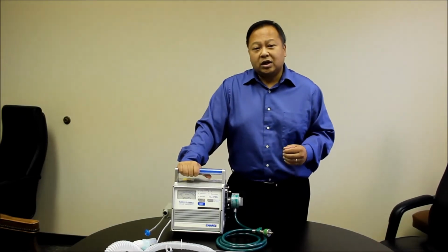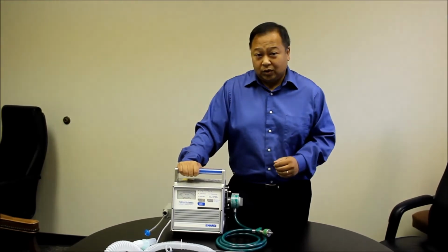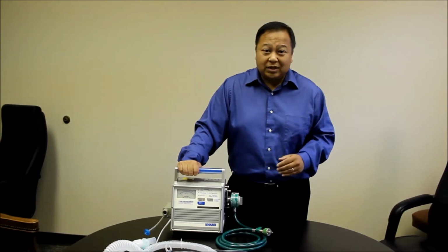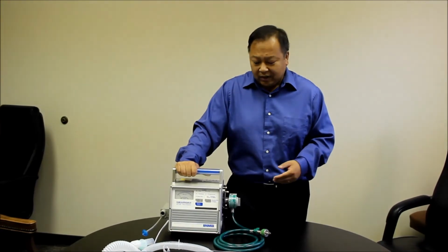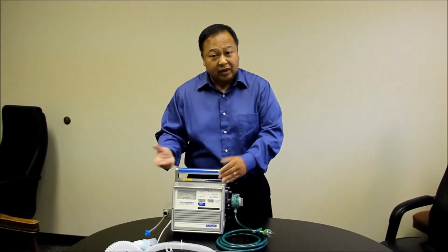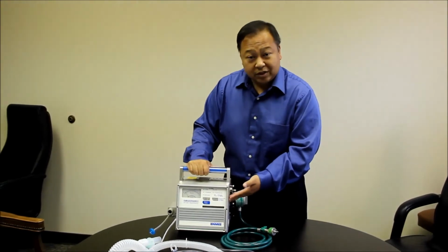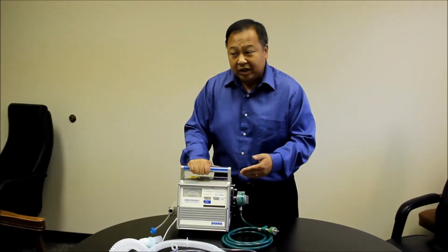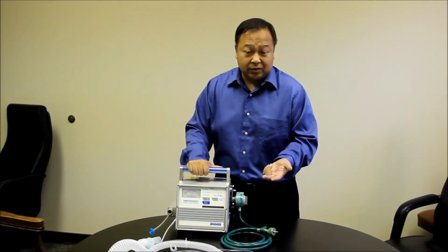Because I want to talk to you about the basics of mechanical ventilation, I'm only going to be talking about volume control. During my years as a respiratory therapist, I want to say 80% of my patients are on volume control. So that's why I'll be focusing on it. I brought with me a ventilator that has both pressure control and volume control, so I'll demonstrate how to place a patient on those modes and what the settings are. For volume control, you can put a patient on assist control, SIMV, or CPAP.